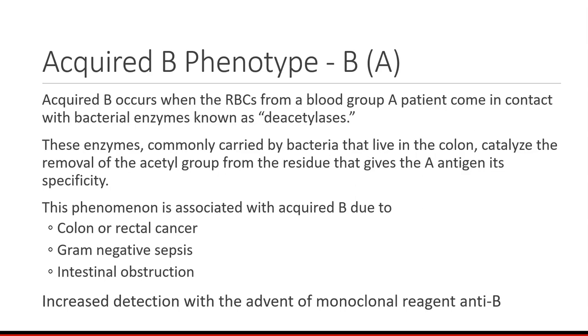And we complained, and it's so funny. People, we're having this problem with our anti-B typings, and they said, well, you're the only one in the whole country who's having that problem. BS. We talked with our colleagues, and everybody was having this problem. So they finally fixed it, and I don't know how they fixed it, but they did, thank goodness, because, again, it caused us a lot of work because there was a discrepancy.